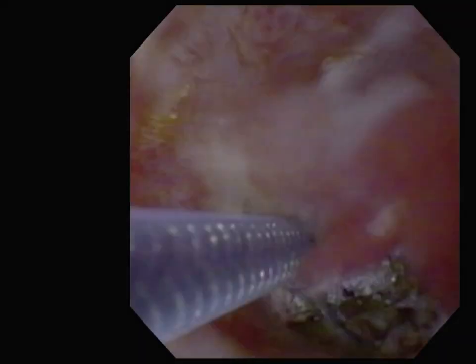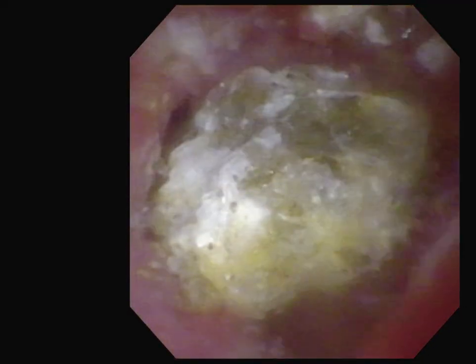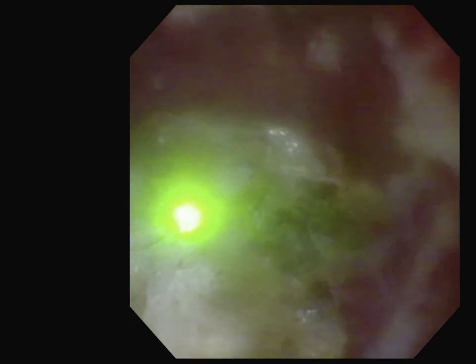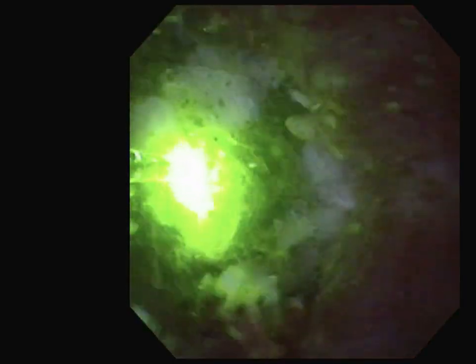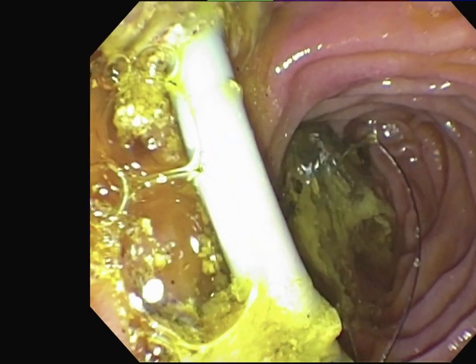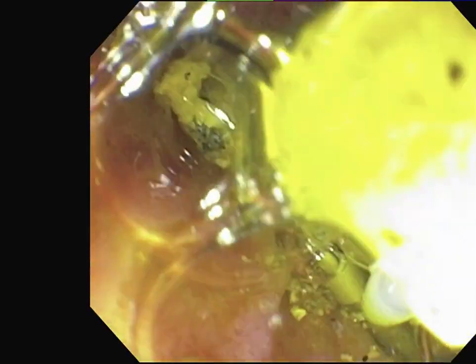The stone fragments were then removed using multiple different stone extraction baskets. Numerous rounds of laser lithotripsy and basket retrieval were performed until the size of the stone had significantly decreased. At this point, several fragmented stones had migrated into the common bile duct. We then performed ERCP.